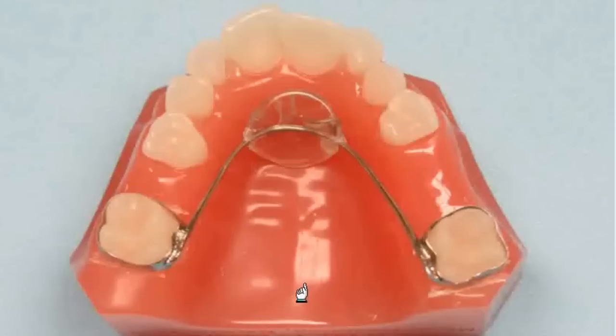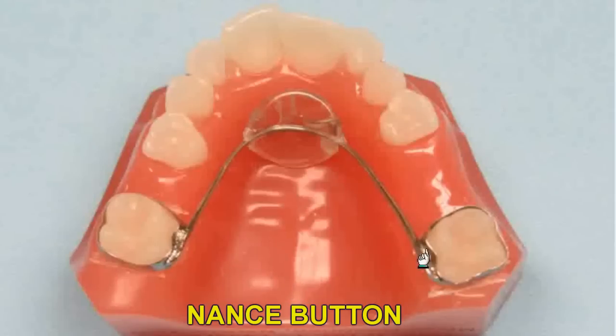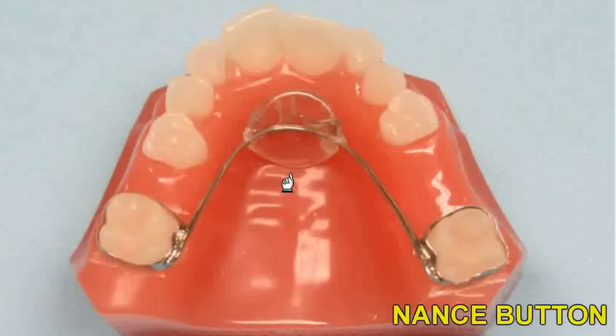On the upper arch, many doctors prefer to use a Nance button as a bilateral space maintainer. The Nance button can be placed on the permanent first molars or second deciduous molars. An acrylic button is made in the palate as anchorage to prevent the molars from drifting forward. This is a very effective appliance. However, some doctors report issues with the acrylic contacting the tissue. Food can get stuck under the acrylic and the tissue can become irritated. It's difficult for the patients to clean under the button. If you're planning on the patient wearing a space maintainer for over a year, this may not be the best solution.